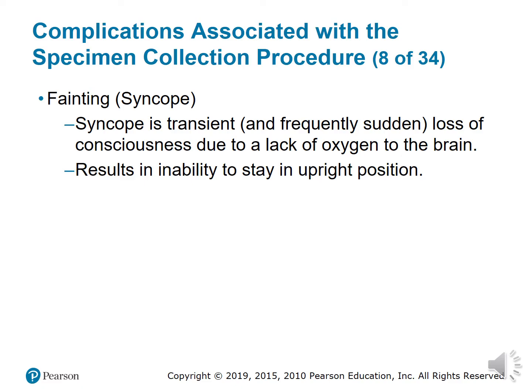So we always talk to the patient. It is always talk to the patient, especially if they're starting to feel faint. If for some reason they do faint, always be prepared to hurry up and remove all equipment from the patient. Pop the tourniquet, remove the needle, tape them up as fast as you can, and make sure that you elevate them up and keep them from falling.